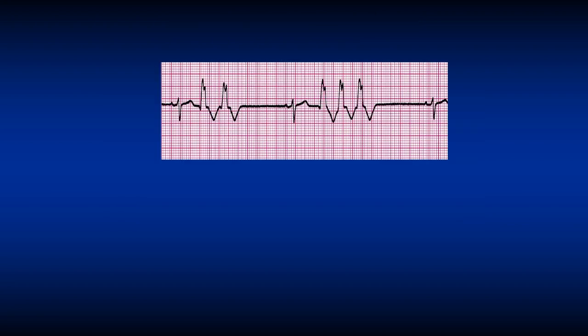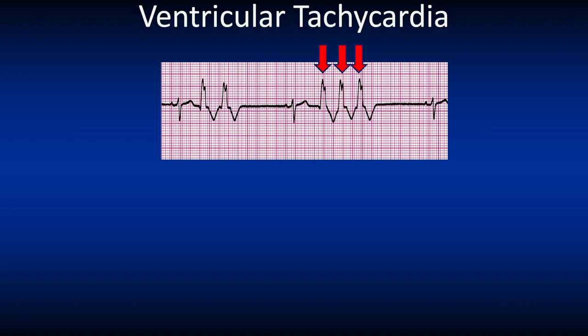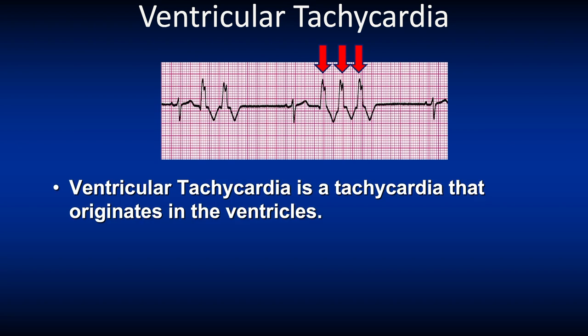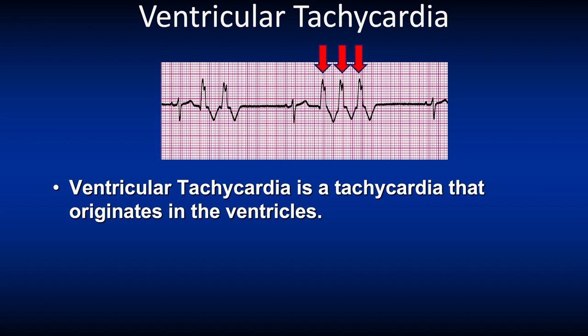Here we see three PVCs in a row — it's a ventricular tachycardia. Ventricular tachycardia is a tachycardia that originates inside the ventricles. It is defined as three or more consecutive PVCs in a row occurring at a rate of 150 to 250 beats per minute. This is called a run of VT.